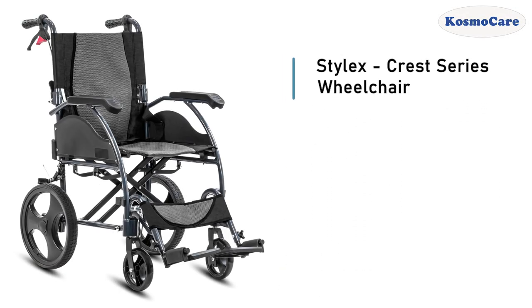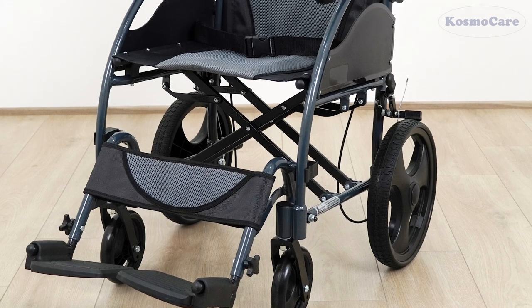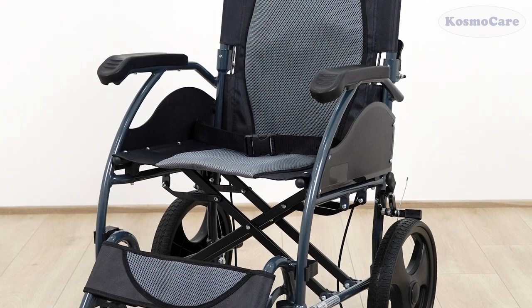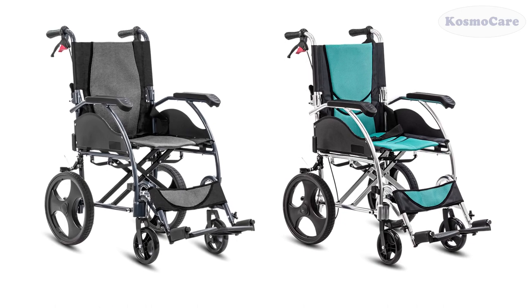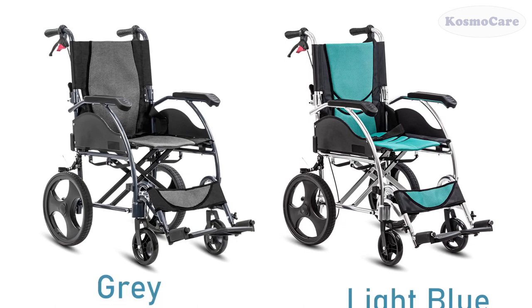CosmoCare Stylex Crest Series Wheelchair offers a durable and dependable mobility solution to users to support independent living. It is available in two attractive color options, gray and light blue.